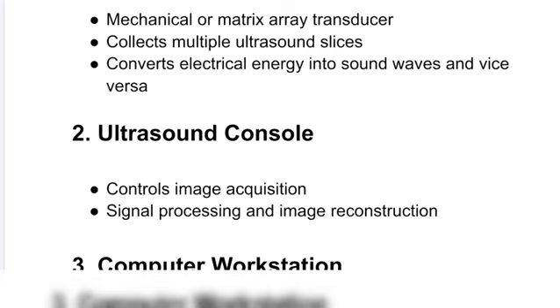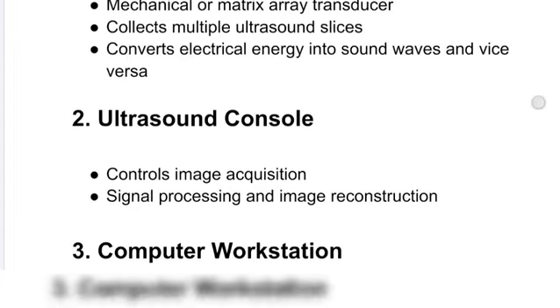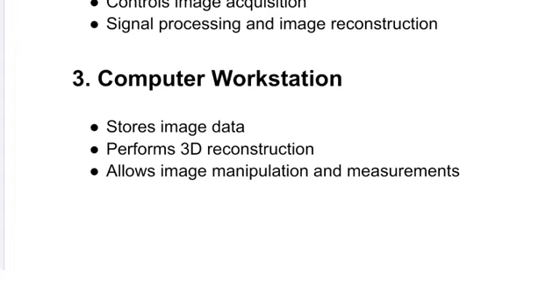Next is the ultrasound console. It controls the image acquisition process, that is, signal processing and image reconstruction. Next is the computer workstation. It stores the imaging data and performs the 3D reconstruction. It also allows image manipulation and measurements.